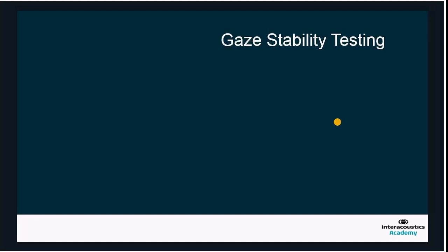If that nystagmus is present with fixation removed, then again this could be present both in positioning testing with the VNG goggle and also, more importantly, within a caloric assessment with fixation removed. So quantifying gaze stability as a primary examination before conducting other oculomotor examinations does have some very sound clinical utility.